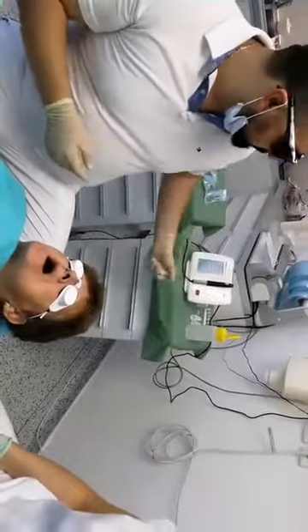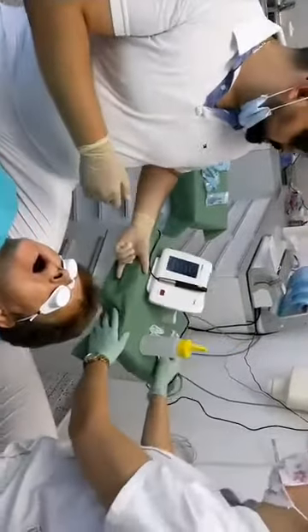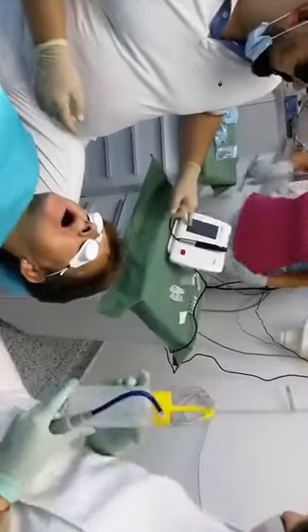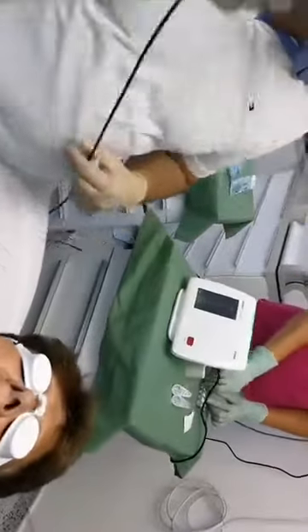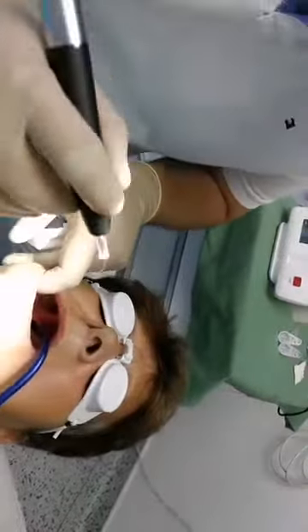We will use the pre-set setting for surgery: 1.2 watts, continuous wave. And we will start with the lower frenulum.